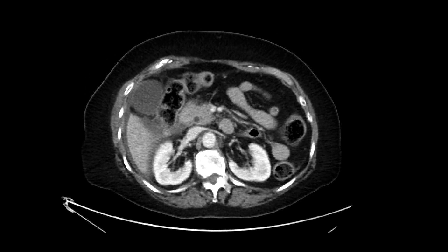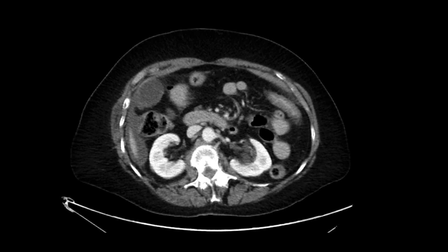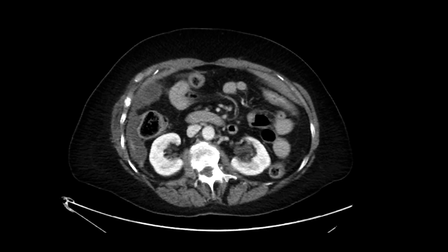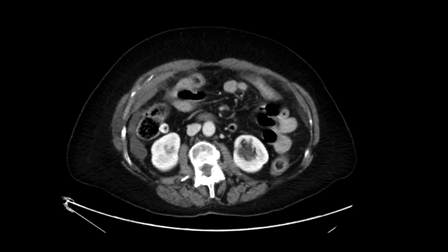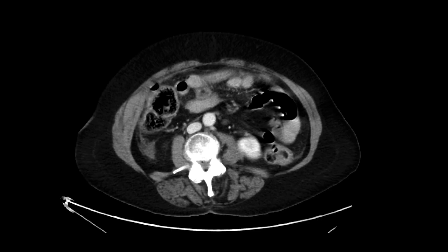As you scroll downwards, we can start to see some of that fluid tracking inferiorly along the right pericolic gutter. Right around there, we see there's a focus of extraluminal gas. There's clearly something going on in this patient — extraluminal gas is certainly concerning for perforation.